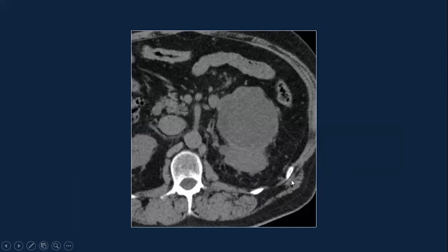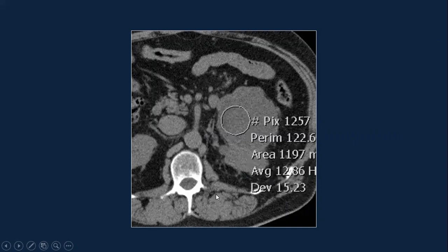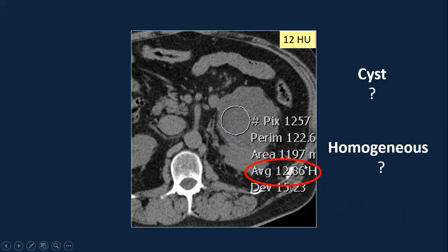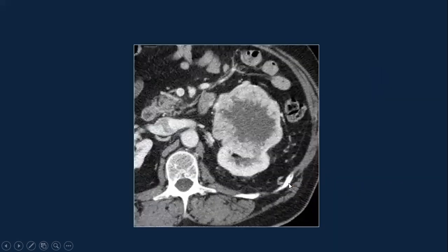The last example shows a large left renal mass with quite a bit of nodularity and stranding, but Hounsfield units measured fluid density — 12. You have to ask yourself: is this really a cyst? As noted, you must look for heterogeneity — and this lesion is clearly not homogeneous. After contrast was given, this was clearly not a cyst. Those portions were measuring fluid density because they had quite a bit of microscopic fat within them.